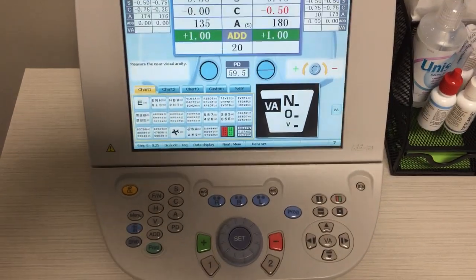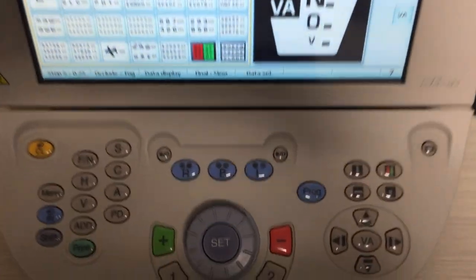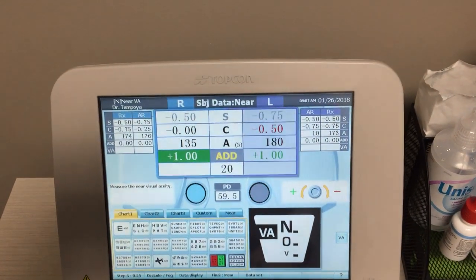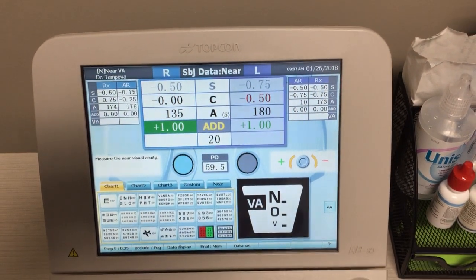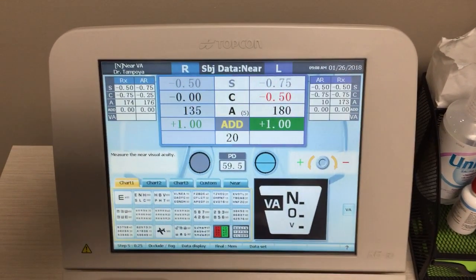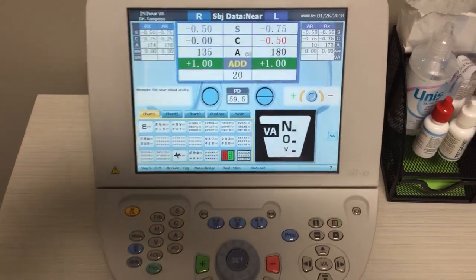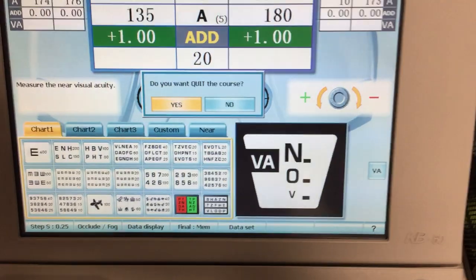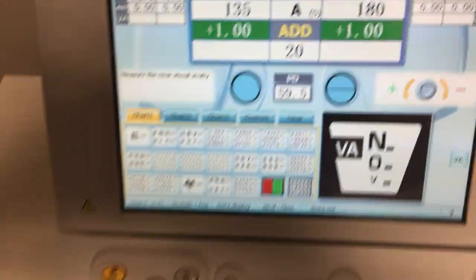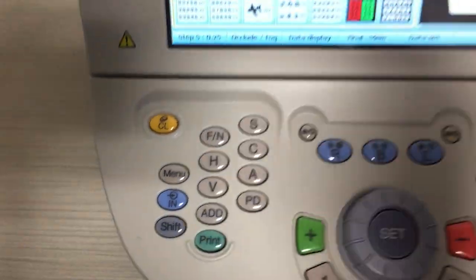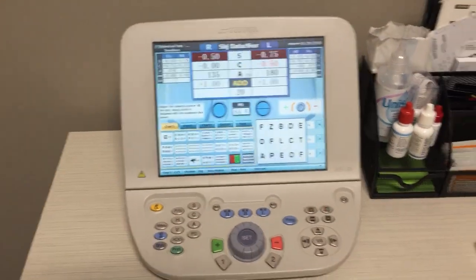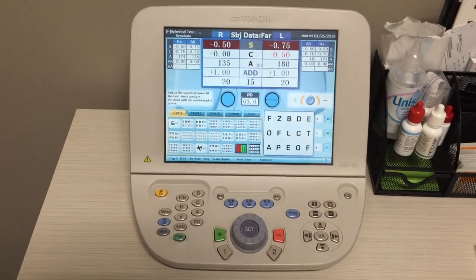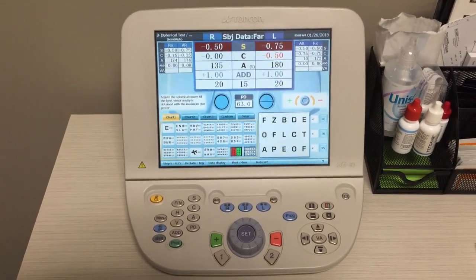Some things to mention: you can toggle between the right and left eye using the blue buttons on top. Press R to test just the right eye — the left eye will gray out. You can do left eye only, or both. The next step by pressing SET asks if you want to quit the course — we're at the end of the refraction. I press SET and then the F/N button so the phoropter goes back to its original state and the near light turns off. F/N stands for far/near depending on what you're testing. That completes the refraction.